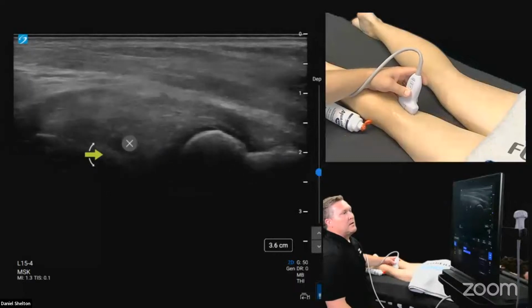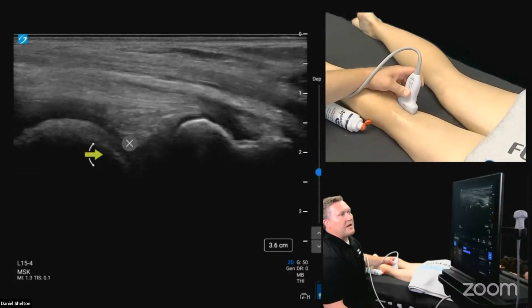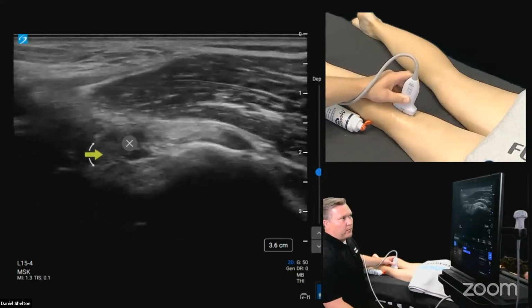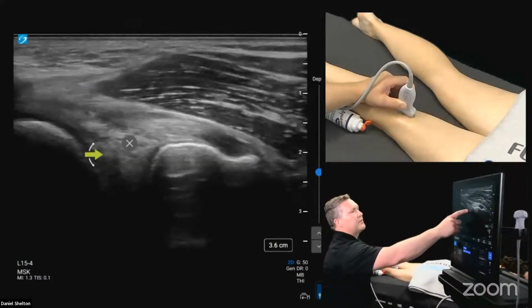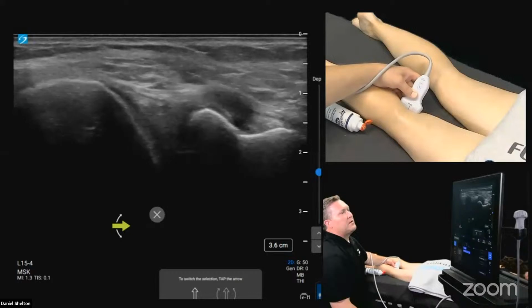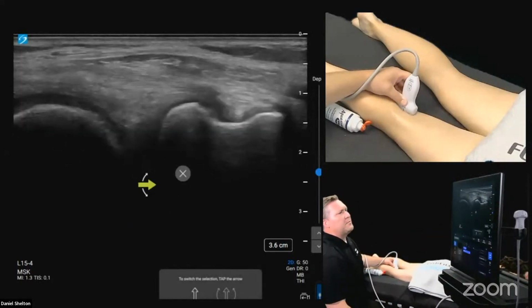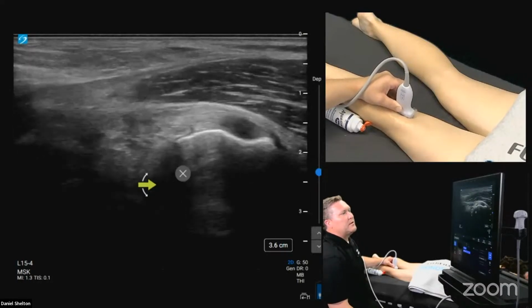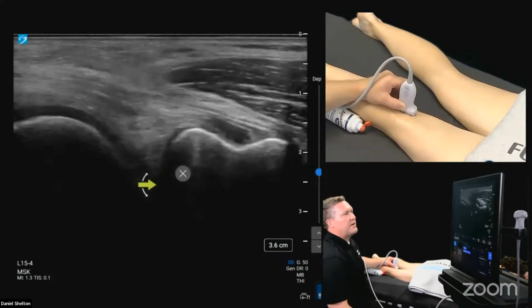And it can only be dealt with by, if you aspirate them, they come back. But if they're painful, it might be worth alleviating the pain. From what I understand, a lot of pressure can build up in those. Incidentally, it's kind of nice. We can see the posterior medial meniscus and its periphery. You cannot see the deep inner edge on everybody, but on some people you get pretty lucky. You can see meniscal cysts back here pretty easily. Not to get too off topic, but we're going to stick with the Baker cyst do's and don'ts right there.